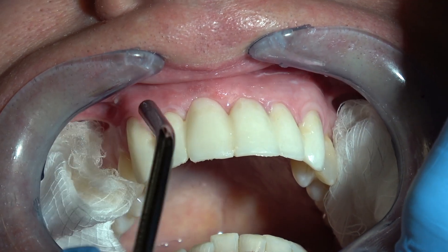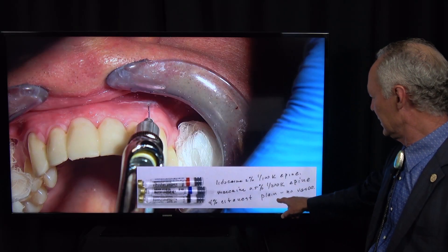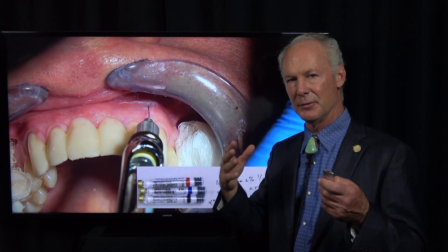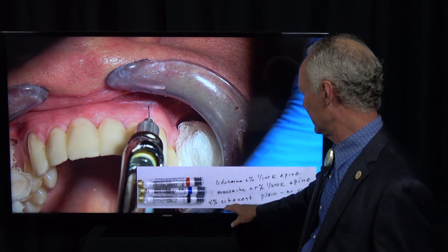Then I'm going to use a 30-gauge short needle with 4% Citanest plain, without vasoconstrictor. Why Citanest? It's pH neutral — it doesn't sting. So we're going to anesthetize the tissue first, then come back with lidocaine or Marcaine to anesthetize the teeth once the tissue is completely numbed painlessly with the Citanest plain.